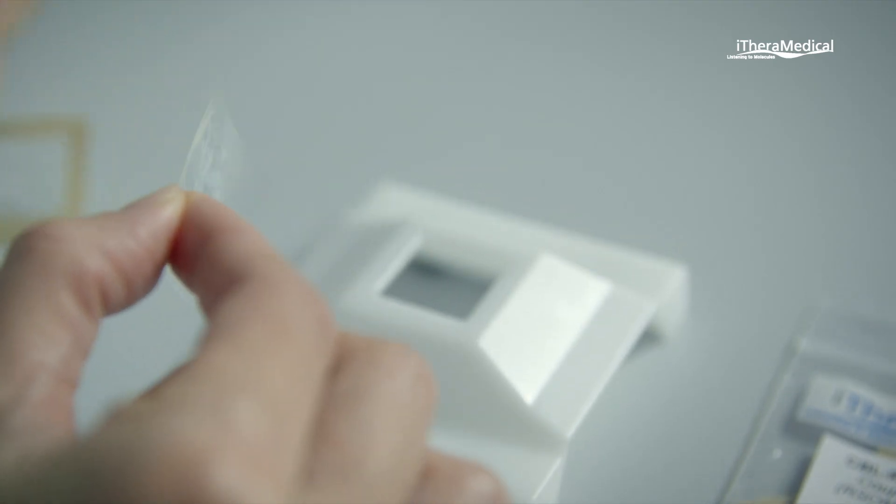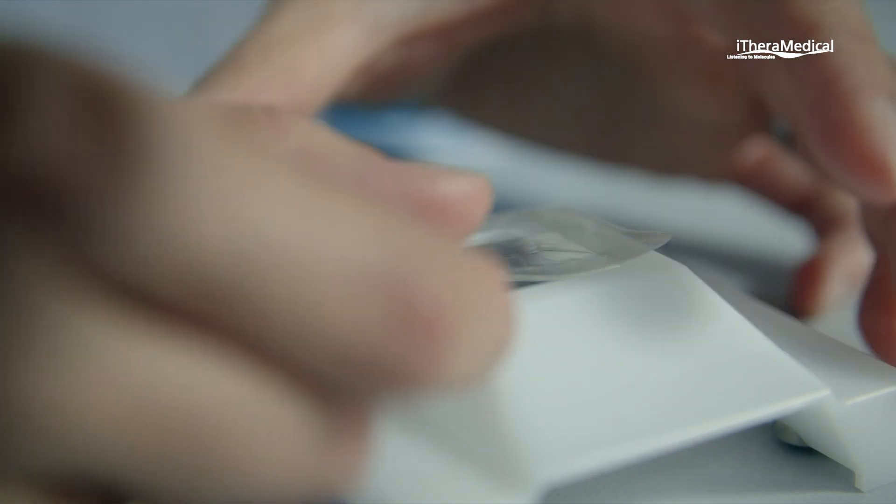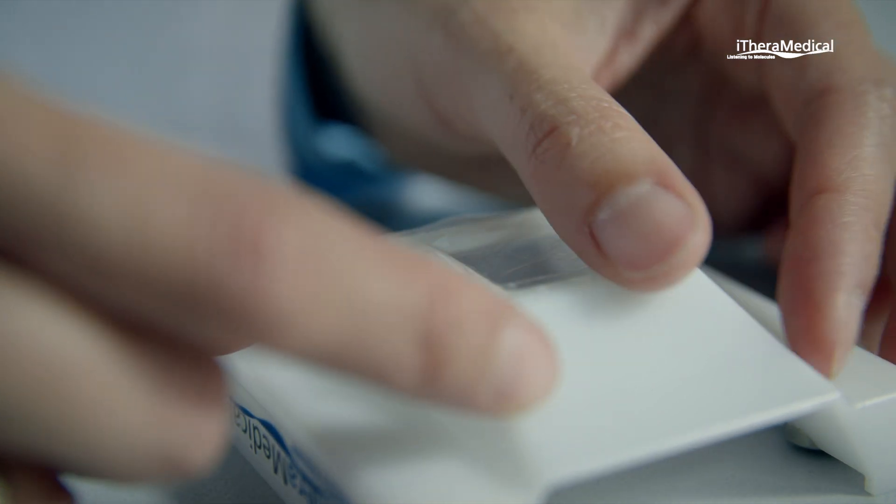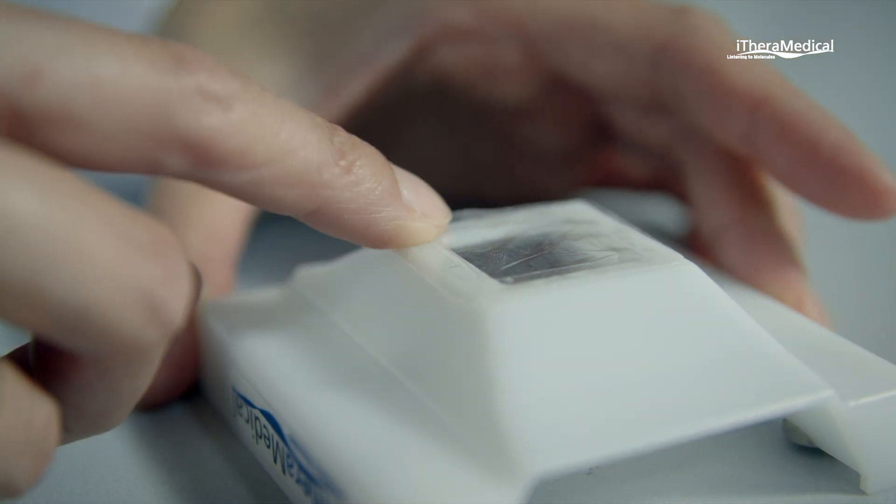Before starting the examination, the scan head is prepared for the imaging session. A new membrane is attached to the interface unit, ensuring that it is pulled tight in order to avoid imaging artifacts.